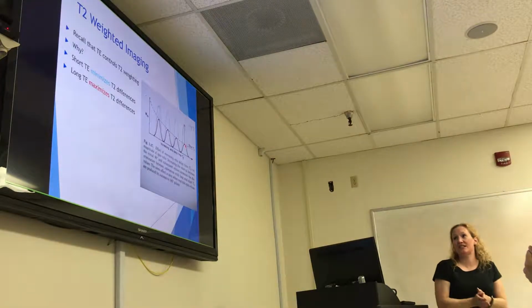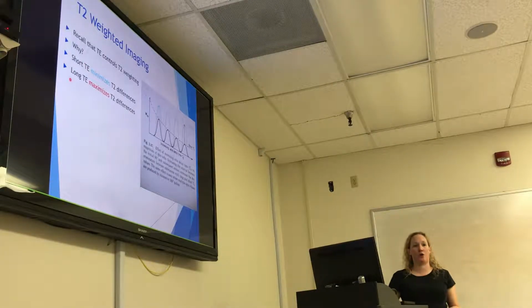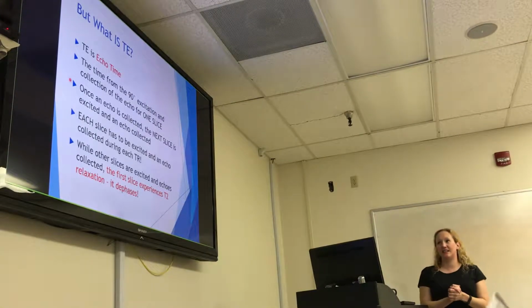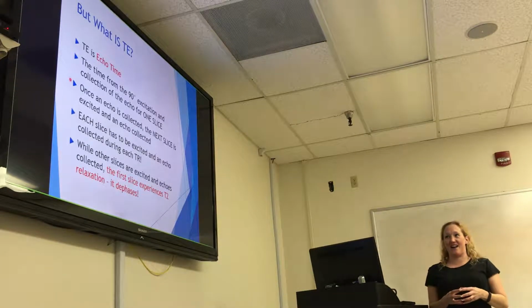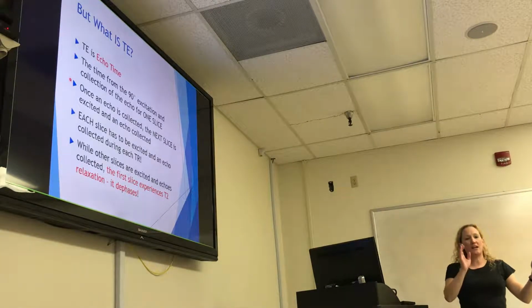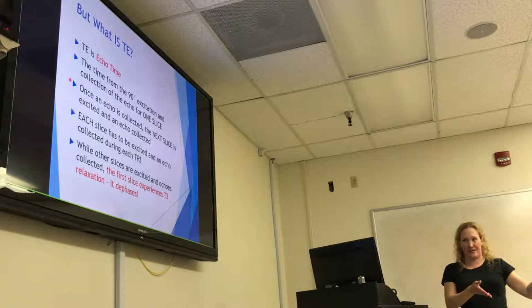All right, so short TE minimizes T2, long TE maximizes T2, but we're doing T2 weighted imaging, so we want to maximize it, which means we need a long TE. But what is TE? TE, and again, it's not ET, it is TE, stands for echo time. And echo time is the time from when we excite our slice to when we collect our echo or our signal, okay? So that's for one slice.